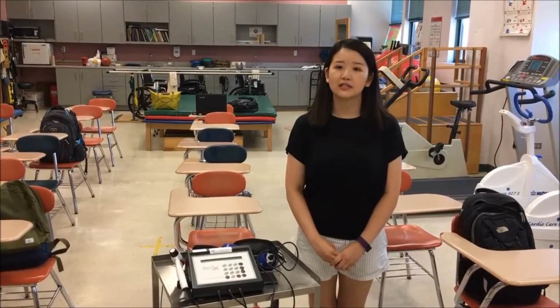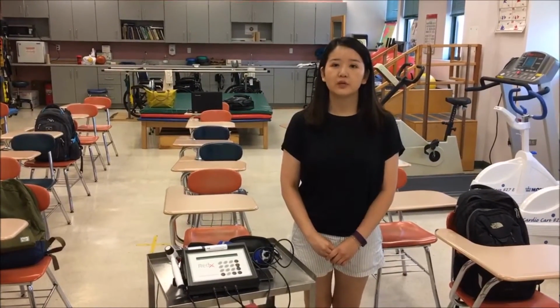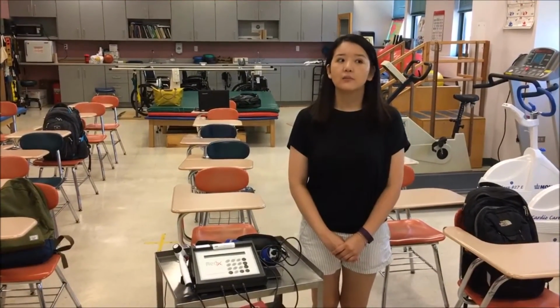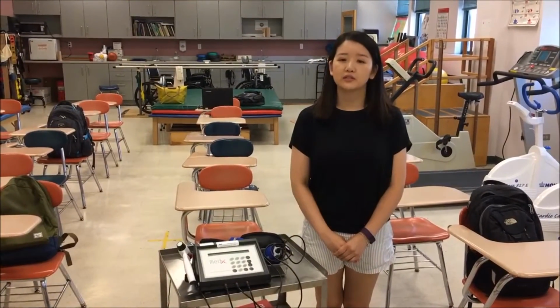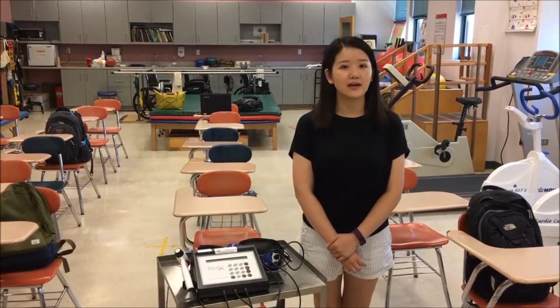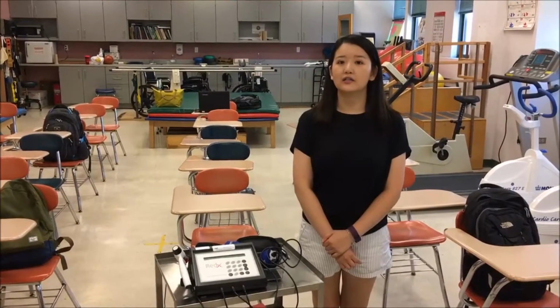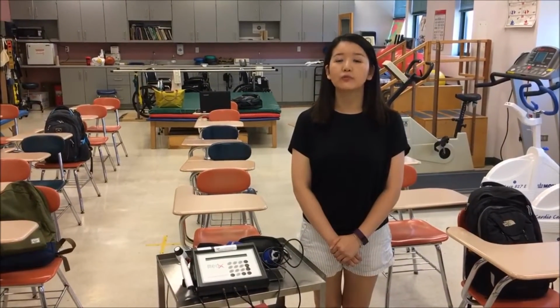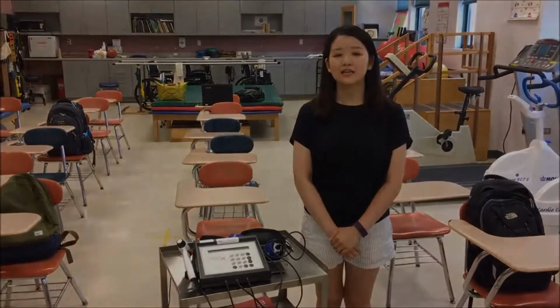Hi everyone, today we're going to talk about how this laser machine can be used in the clinical field. The laser machine can be used in many ways, such as to promote collagen production, promote vasodilation, promote tissue healing, and modulate inflammation to treat patients with ulceritis, lymphedema, neurological conditions, and pain management. Moreover, the laser machine is the only modality in the physical therapy field which can be applied directly on the bone. So let's get started.